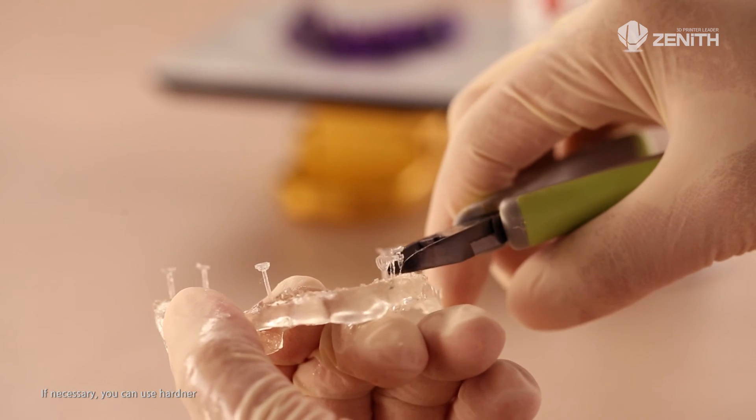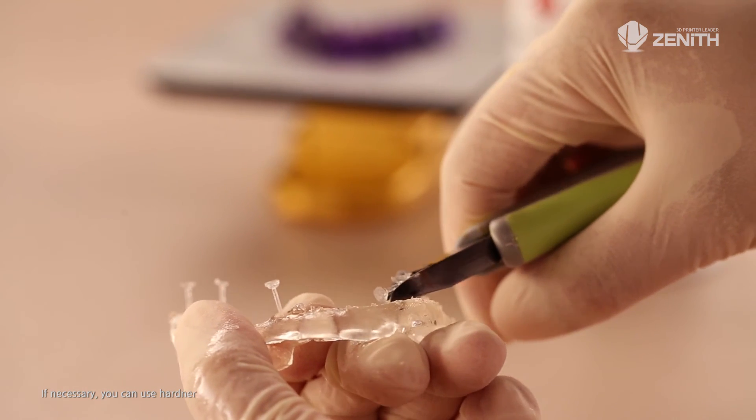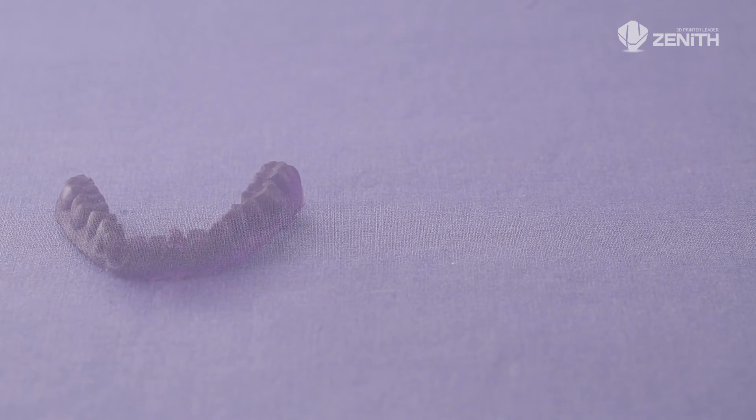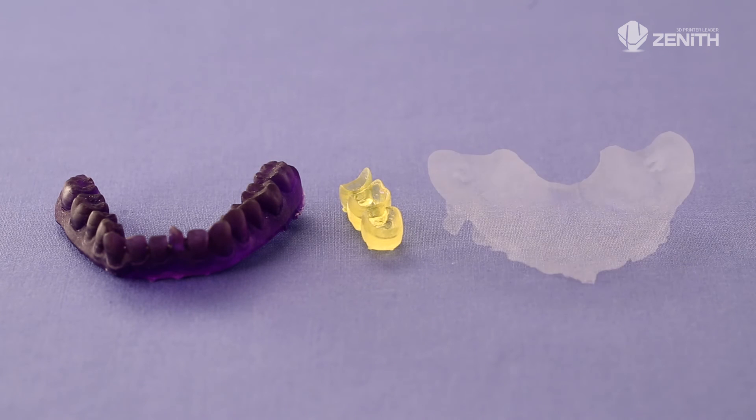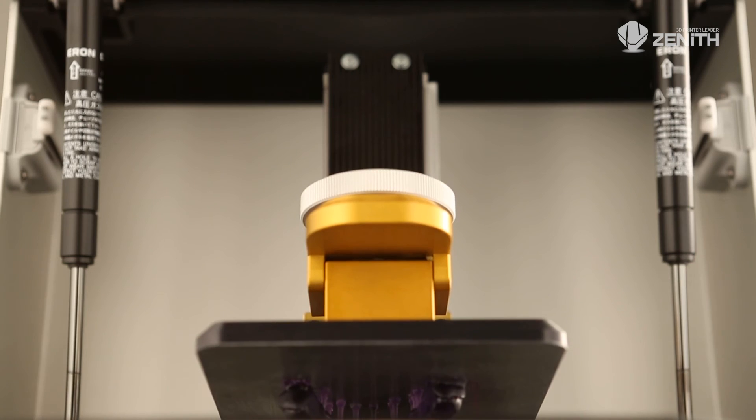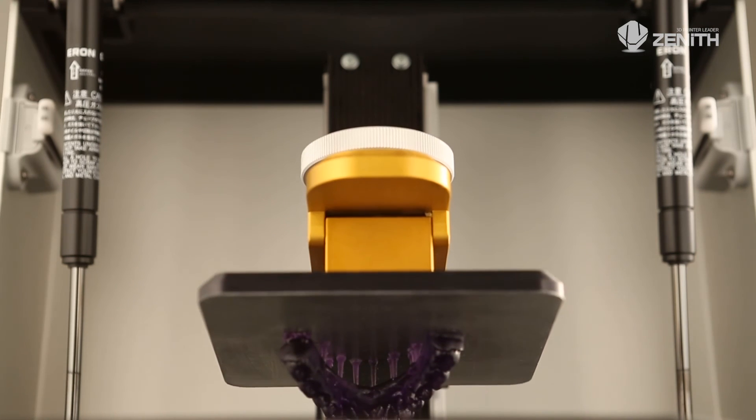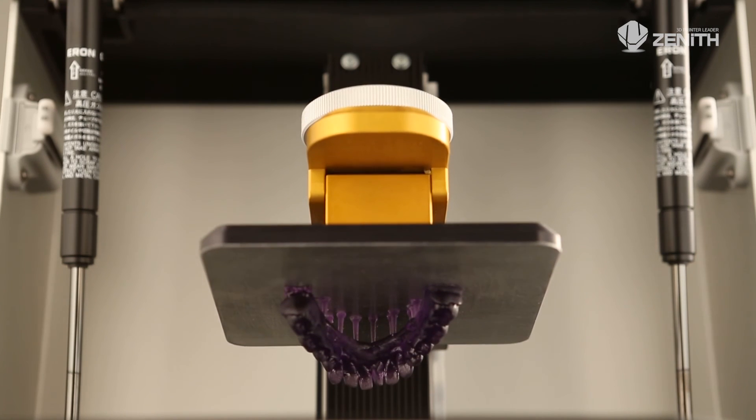After the model is dried, remove the support. Now the first model made by the Zenith 3D printer is produced.